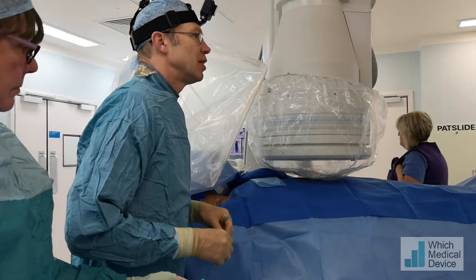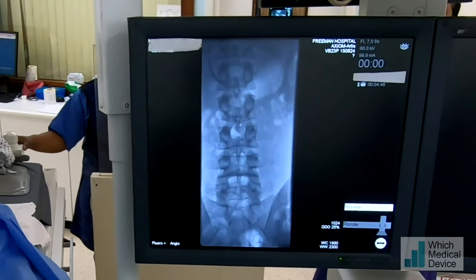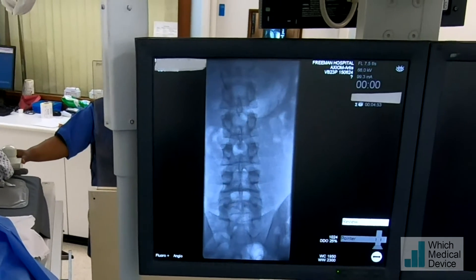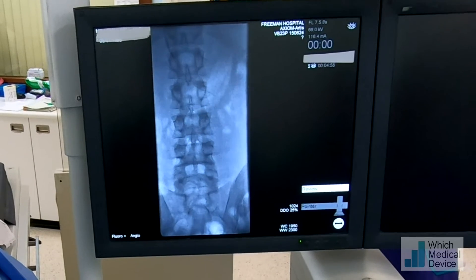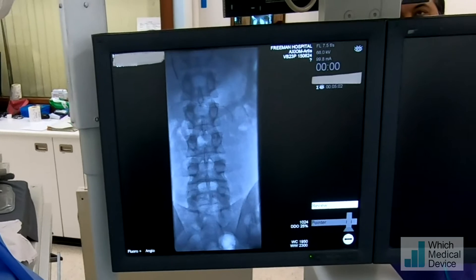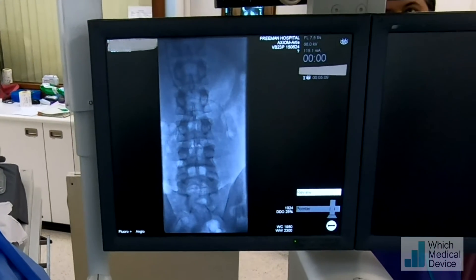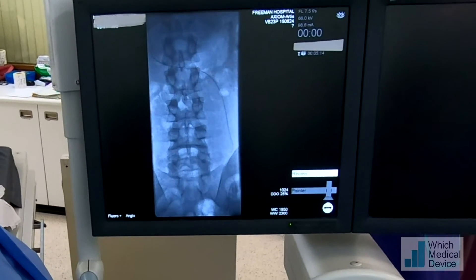We've got the multi-purpose catheter down into the IVC, and I'm facing it towards where I think the left renal vein is likely to be. The hydrophilic wire has gone straight into the left renal vein. I'm now going to pull it back, turn it thoroughly, and see if it'll just pass down the gonadal vein. You can see it's hooked into something there, so I'm just going to advance my catheter into the left renal vein. The wire's going down the gonadal vein, so I'm going to advance the hydrophilic wire down the gonadal vein.